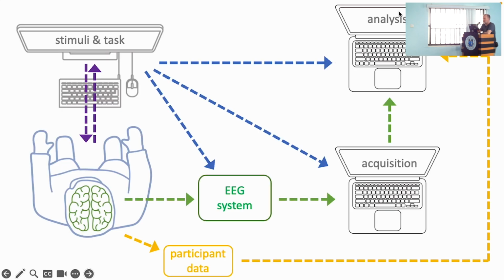So it's very much on the analysis, but for frequency analysis, we're not necessarily expecting a very precise timing. So what we're now basically assuming is that these arrows don't really exist. So there's just a very approximate timing, so you know when the participant closed their eyes or opened their eyes, but it's not necessarily indicated with a very precise sequence of triggers.